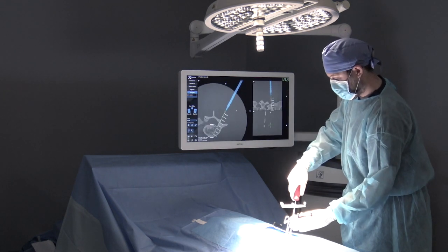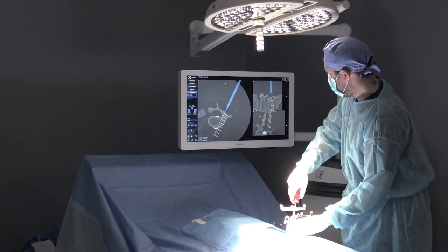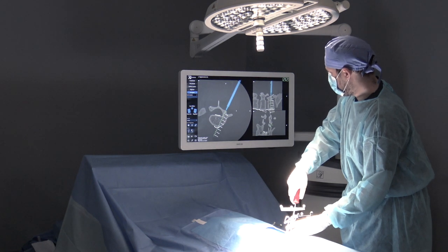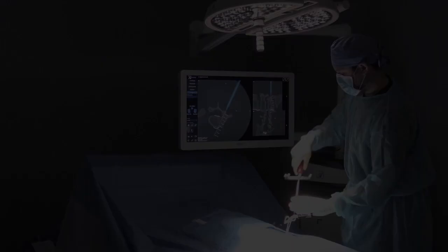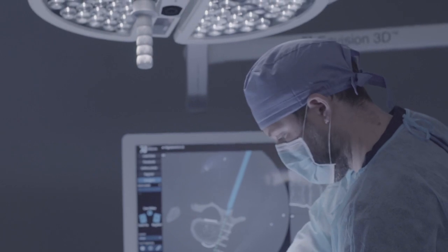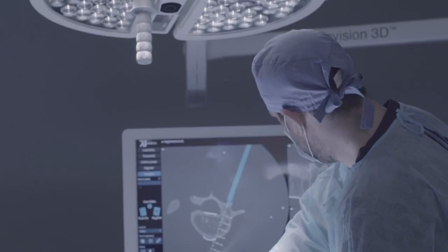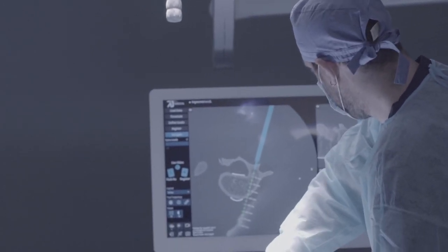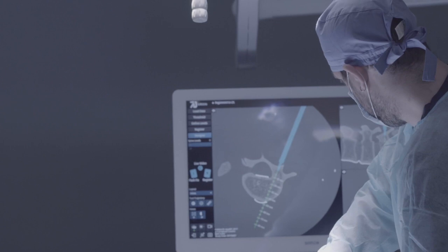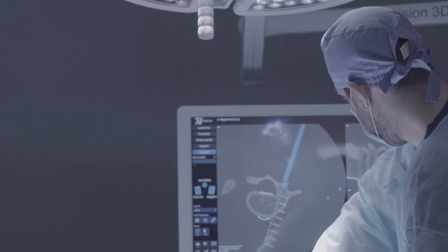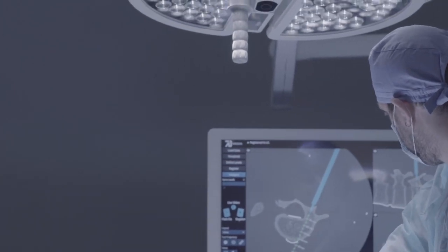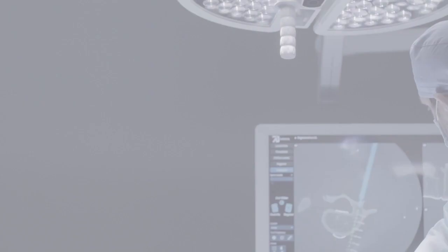Only the machine vision technology of 7D Surgical is capable of these unprecedented workflows. The 7D Surgical system: fast, efficient, and radiation-free at a fraction of the cost of competing systems. Visit 7dsurgical.com for additional information.